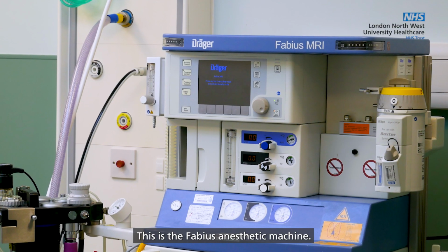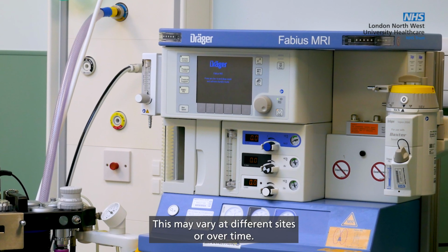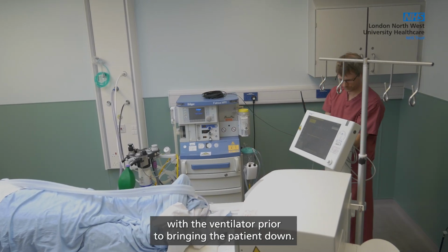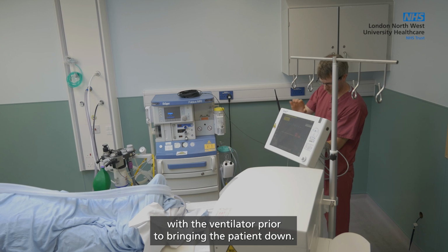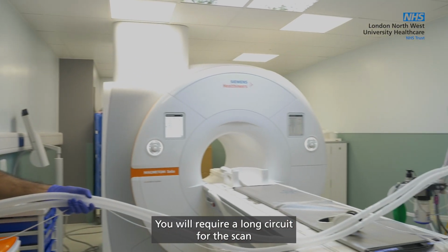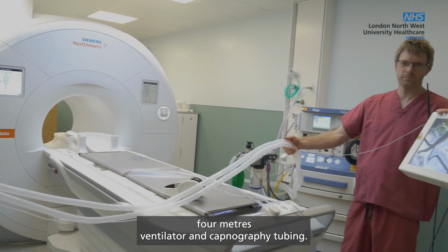This is the Fabius anaesthetic machine. This may vary at different sites or over time. Please take time to familiarize yourself with the ventilator prior to bringing the patient down. You will require a long circuit for the scan, 4 meters ventilator and capnography tubing.